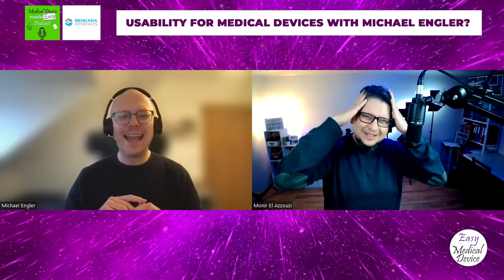I see that also a lot of people that are trying to do that are trying also to talk to the people that are doing it, say, oh, no, you should do it like this. No, you should refrain from doing that. You should try to stay in the back. You have just to observe, to find where they are making the mistakes and then finding a way to improve. And what we usually do is the manufacturer sits in another room and they can watch on screens so that we have enough room to leverage if someone bites the table because they can't use the device.